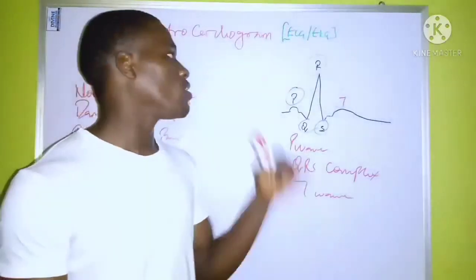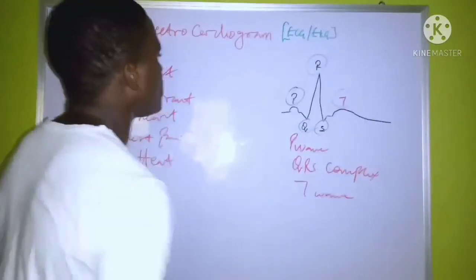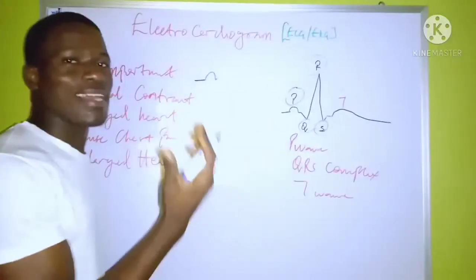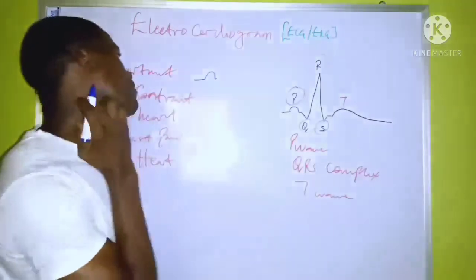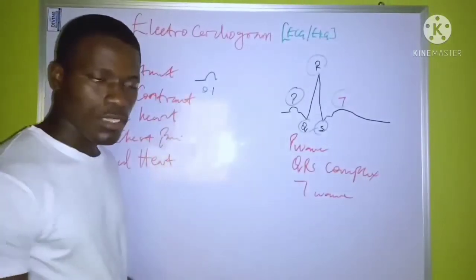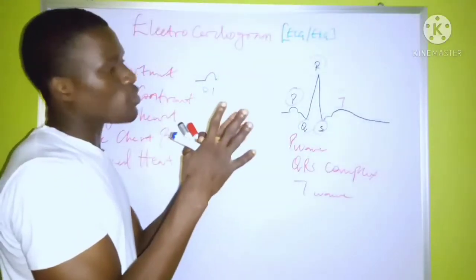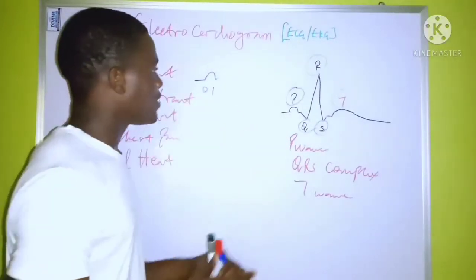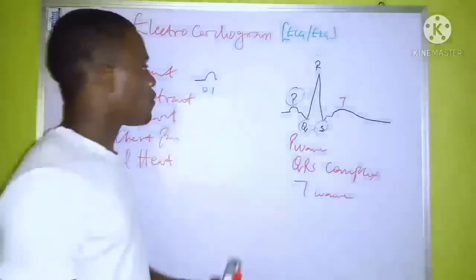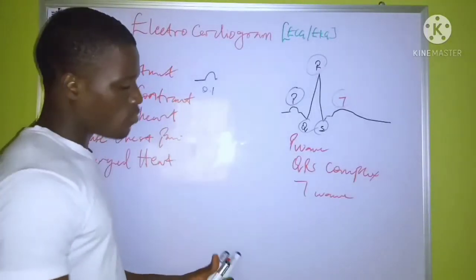Going into detail of the explanation, the P wave starts with a little curve which goes from up to down. This is the P wave. The stimulation of the SA node, that is the action potential from the SA node, will cause the atrium to contract, and this usually lasts about 0.1 second. That's the time frame for the P wave to form. The left and the right atria are contracted upon action potential from the SA node. When this occurs, it forms a slight curve which comes downward and back to the line. So the next now is the QRS complex.